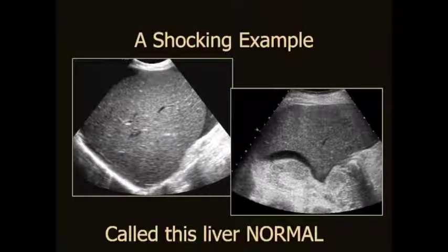And so when I look at this picture, I think, you know, that's a pretty good call. It looks pretty normal to me too. So what happened was the patient was taken to the operating room for emergency surgery because they thought his abdominal pain was related to a leaking aortic aneurysm. And it was the anesthetist who phoned me and said, "Stephanie, can you come with your machine and those bubbles to the operating room? I would like you to look at this liver before I anesthetize this patient."